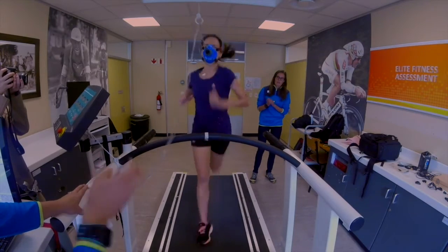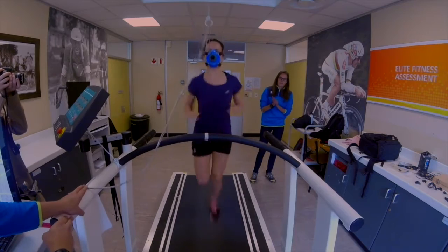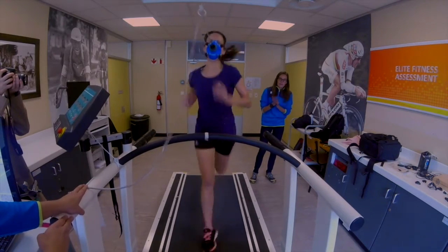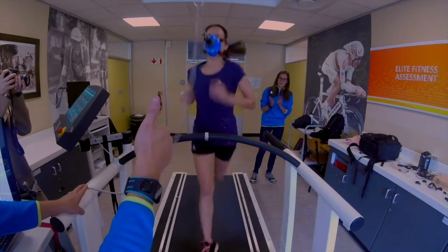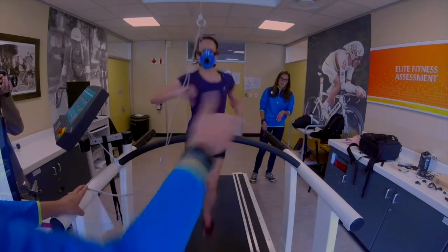You're uncomfortable — you hope you've got 25 seconds to finish the stage. Come on, come on, 30 seconds — go, go, go! That's it, that's it — control, control. Jump, jump — okay, hop, hop.